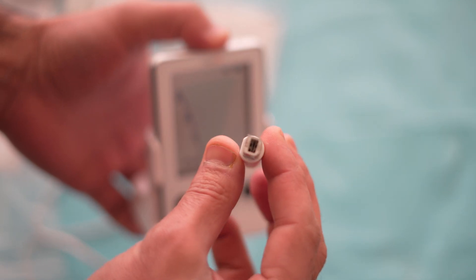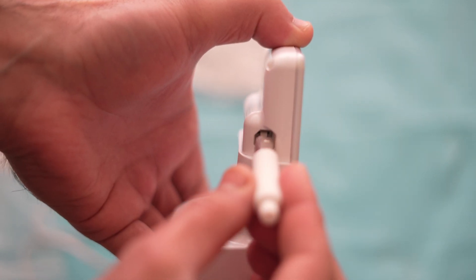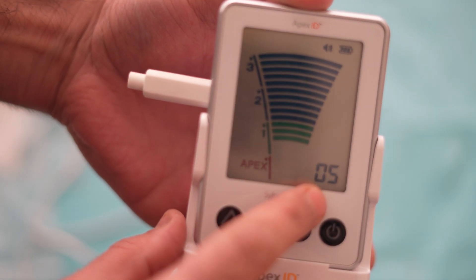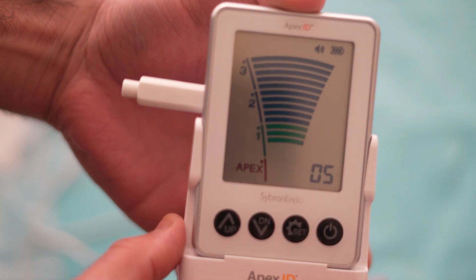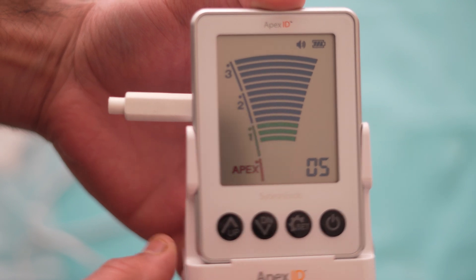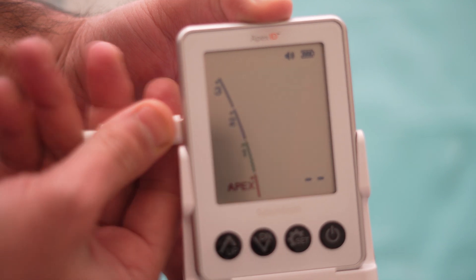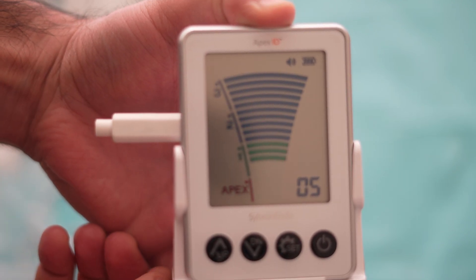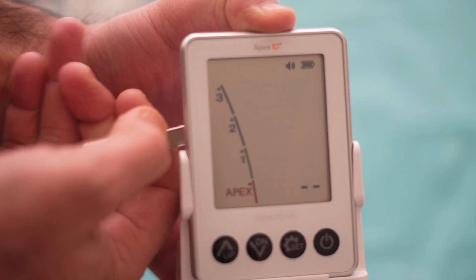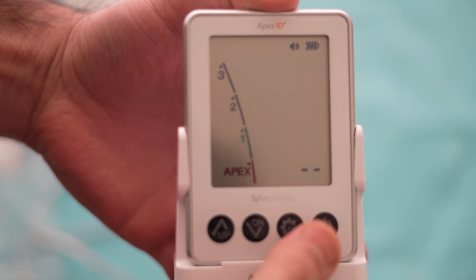Talking about the checker — this is an important tool as it shows you that your Apex locator is functioning correctly and is ready to use. When I insert it, I get a 0.5 mm reading and beep signals, which means your Apex locator is correctly working and you won't get an incorrect reading while taking the working length. Some Apex locators are not provided with this checker, so this is a plus point for the Apex ID.